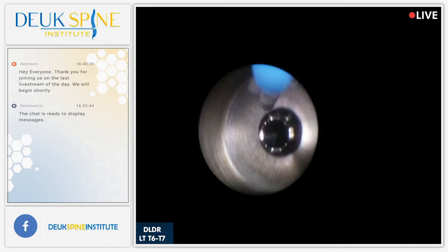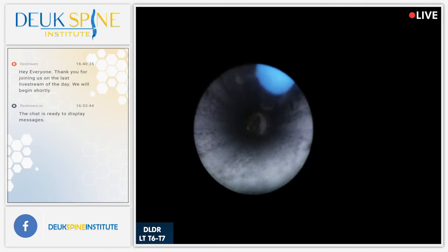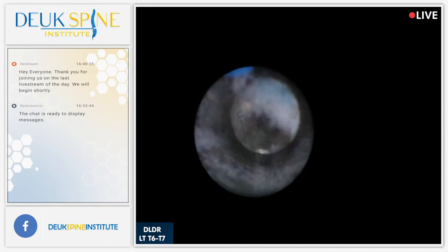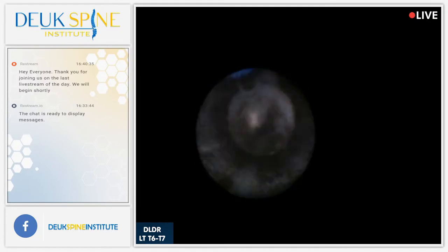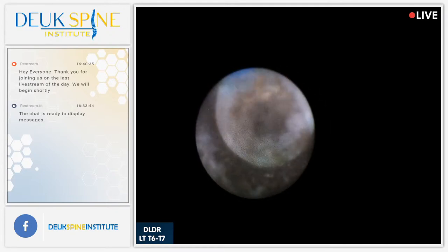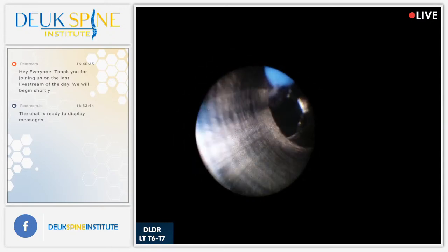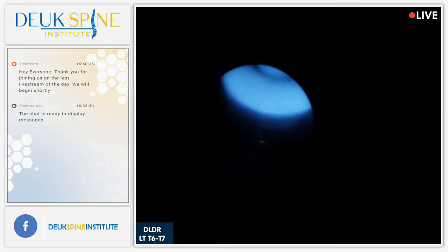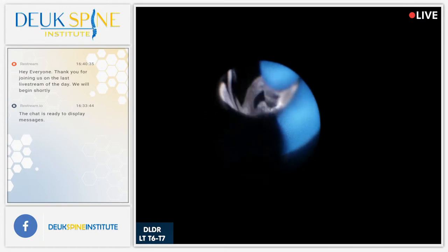What's the problem with the irrigation? It's hard to believe we haven't used that much irrigation. Well, there's a block in the line somewhere. You've got to find it. I have to check. Let me tell you in a second. The coldness is fine. It's just, look at the debris. It's not coming up fast. It's barely moving. I don't think it's the bag. Look at that. There's no pressure. It's weak. It's not at 700 PSI, that's for sure. Do you switch to the other one, John? This heat switch one? Yeah.